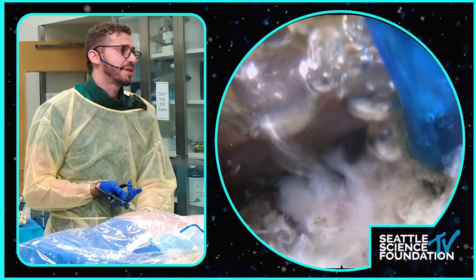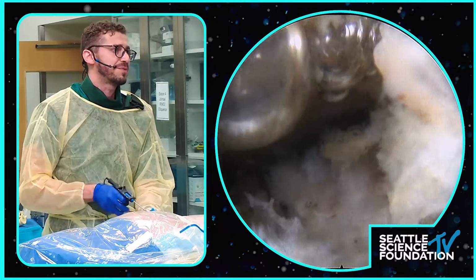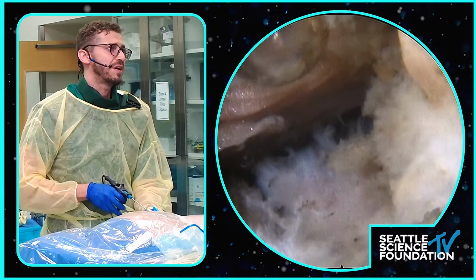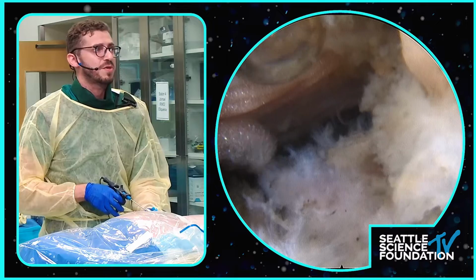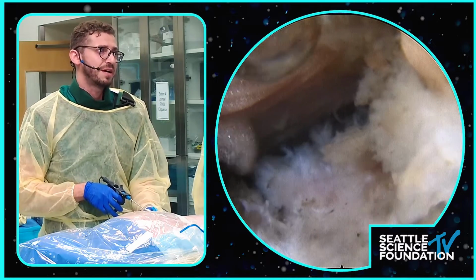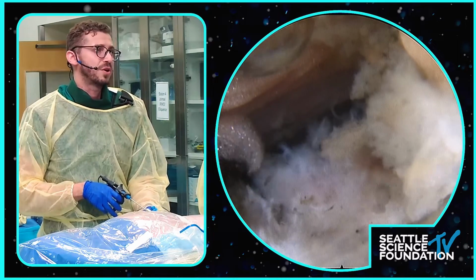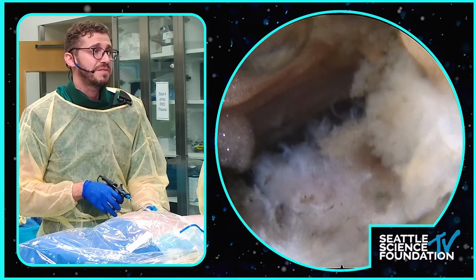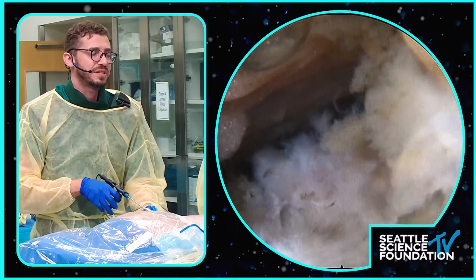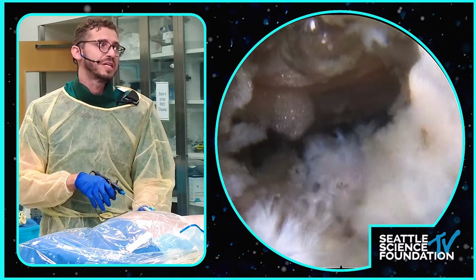And I think, when it's decompressed, you see it pulsating too, but I wouldn't go by just the pulsations because sometimes there's still more disc there. When you take a humongous disc fragment out, you think you're done, but there's usually more. So I would say keep looking. I don't know if it gives you recurrence rates, or maybe it just goes away on its own, but I usually spend more time, even after the big chunk comes out and you're super pumped and everyone's high-fiving, just to make sure that there isn't an additional disc fragment. And honestly, there usually is.